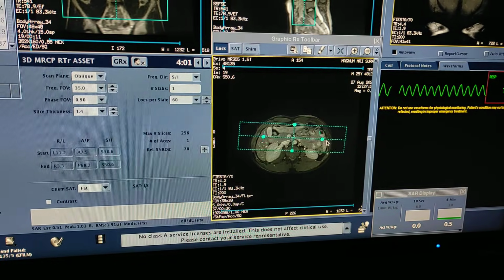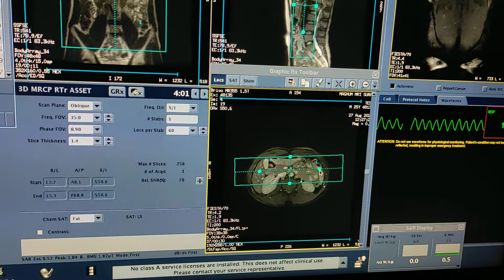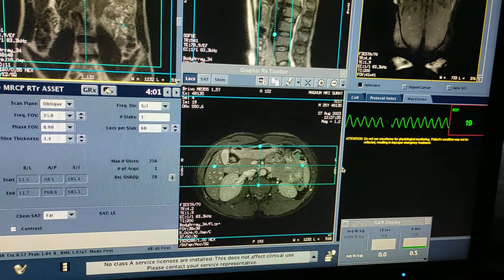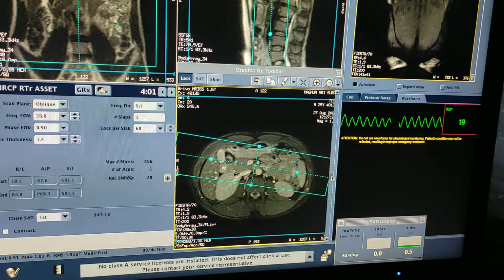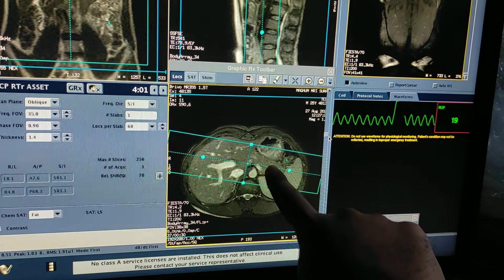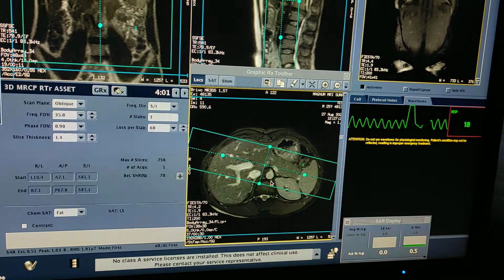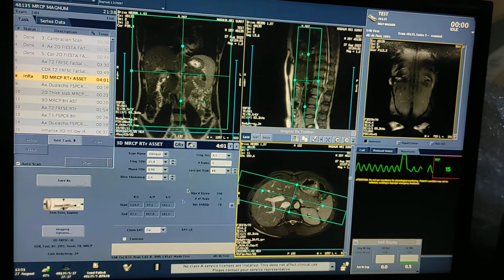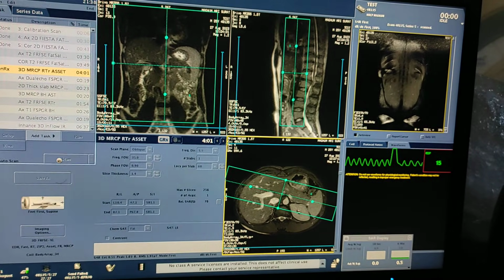First of all, you have to set your FOV with a true coronal plane. Okay, I will set my FOV over here. Then you have to angulate on axials. This is the angulation for 3D MRCP. You need to cover the tail of pancreas, because the cystic duct angulation is like this, oblique, or you can do parallel to pancreas. So this is the planning for the 3D MRCP. Always you should run the 3D sequence first of all, after getting this 2D Fiesta.